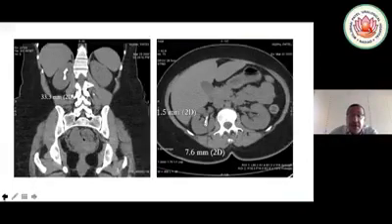Okay. So at the end of the day, this is, of course, not an easy supine, because the trajectory, the axis should be more posterior, also because we have the liver and then we have also the rib. So my strategy would be to go supine with the major inclination of the patient, but for sure also to do a paraspinal puncture in prone can be an alternative.